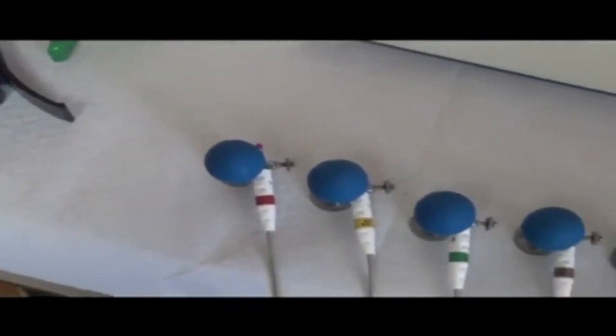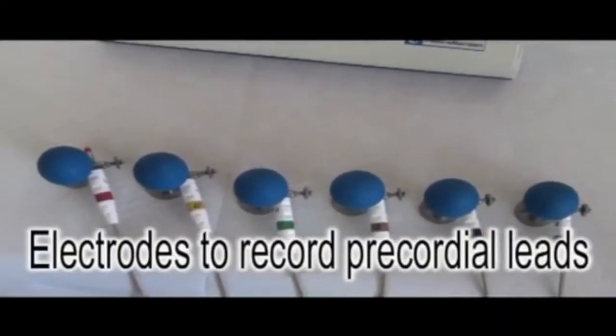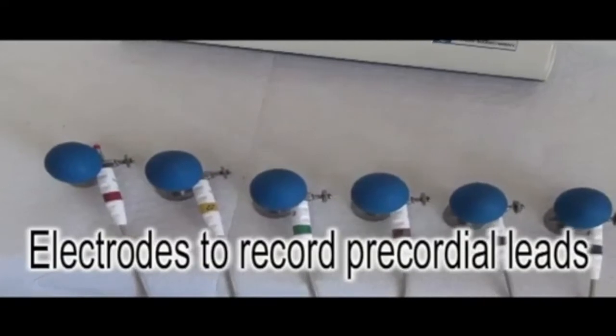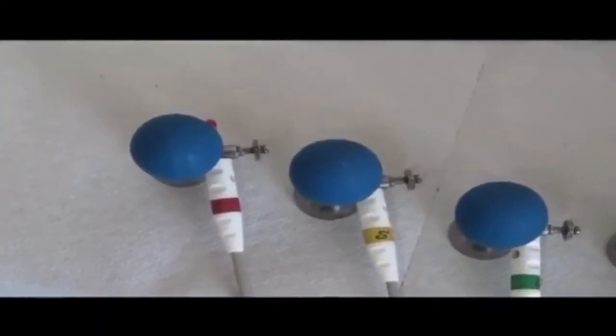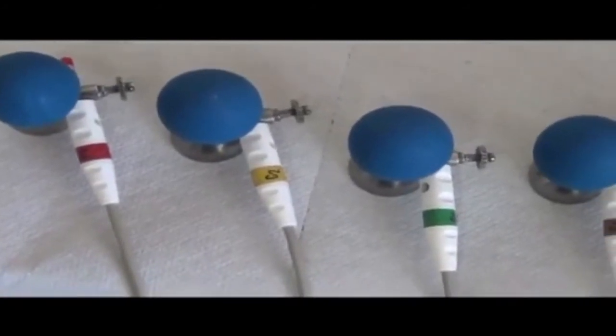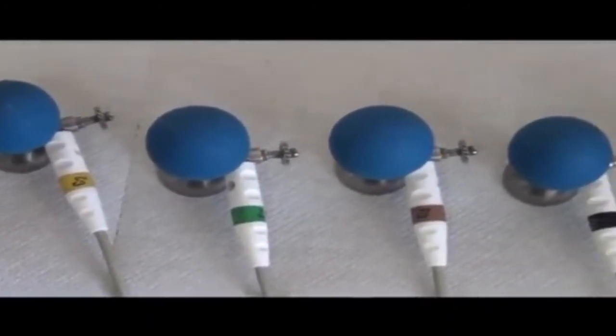Besides, we should also use electrodes for the chest leads. If you use a single-channel ECG, you will have only one electrode, which you should move frequently from V1 to V6. If you use a multi-channel ECG, we prepare six chest leads.